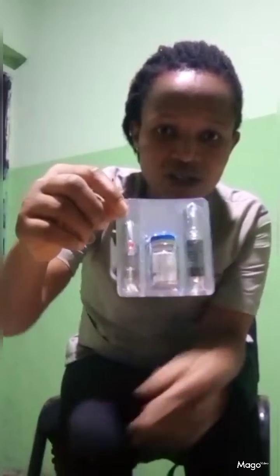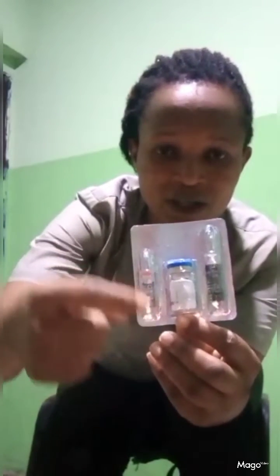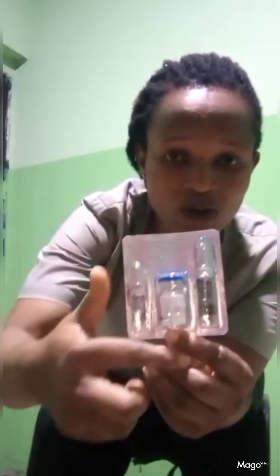Artesanate comes with two liquids. The small one, which is the sodium bicarbonate, and the big one, which is the sterile water.